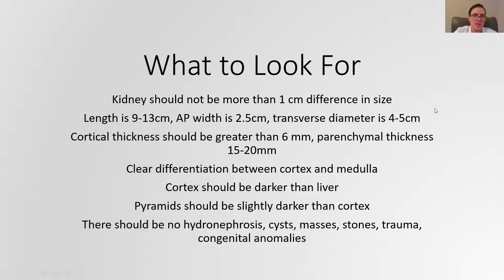You also want to see a clear differentiation between the cortex and the medulla. If you can't see that, it can hint that maybe there's some kind of inflammatory process going on. The cortex should also be darker than the liver — if it's not, that gives you some sense that maybe there's scar tissue or something making the kidney more echogenic than it should be. The pyramids in the kidney should be slightly darker than the cortex, but only slightly. If they're substantially darker, that can actually be indicative of kidney disease like acute tubular necrosis.